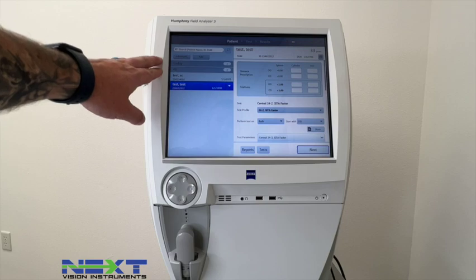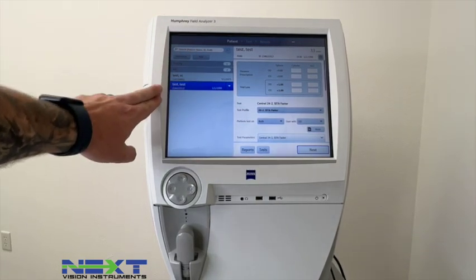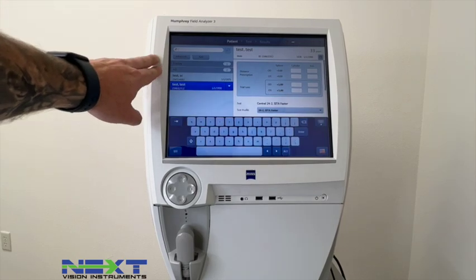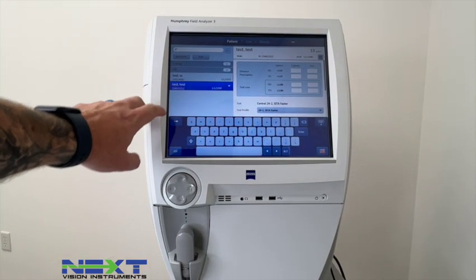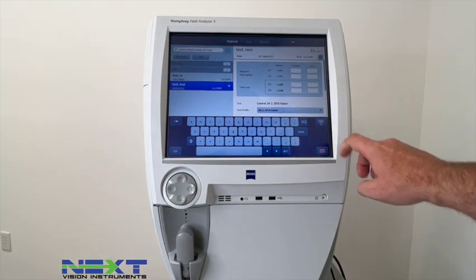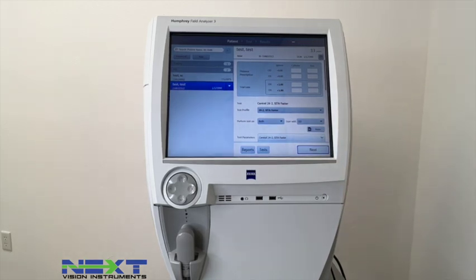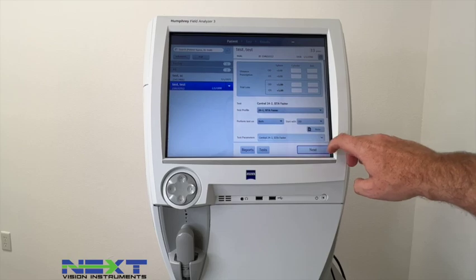When entering a new patient you hit Add, but if you're pulling up an existing patient go into the search bar and search by last name or date of birth, then select that patient. Pull them up and if their glasses prescription has changed you would update that, then click Next. Depending on whether you're running a 24-2, 30-2, or 10-2, you select the appropriate test.